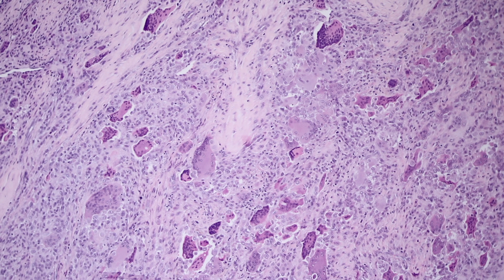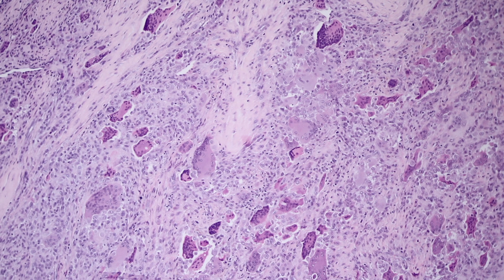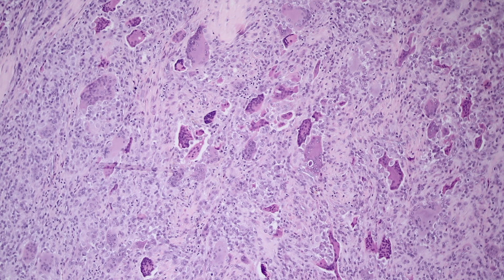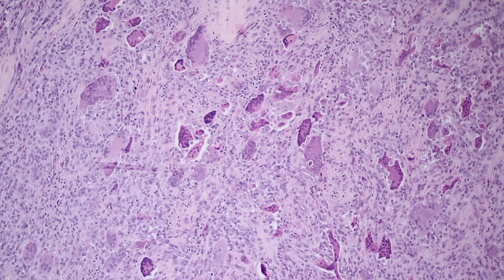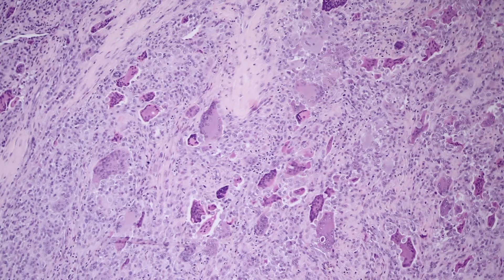We're going to walk through the different features of these tumors in this video because they're relatively common. When you see a case where you see giant cells everywhere, the first thing that comes to mind is giant cell tumor. But there are cases that do not have very many giant cells, or have no giant cells at all. So I always tell my trainees they have to learn to recognize tenosynovial giant cell tumors without the giant cells — looking at all of the other features in the background that will help you make the diagnosis.